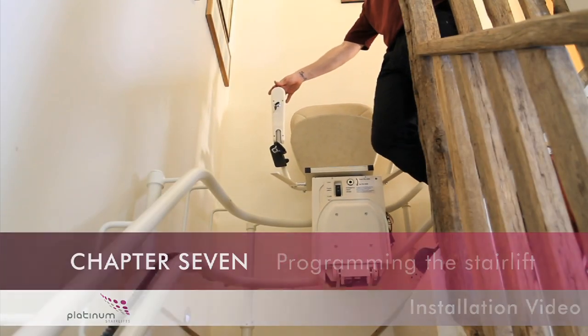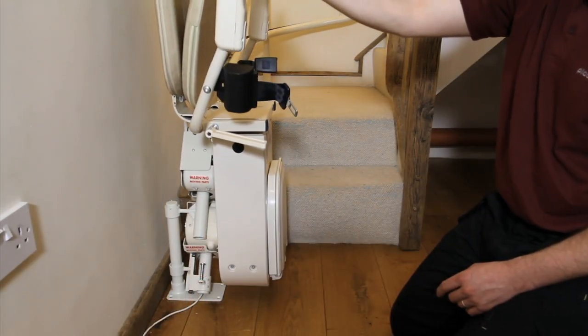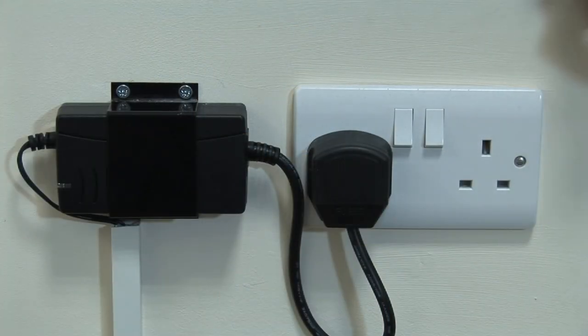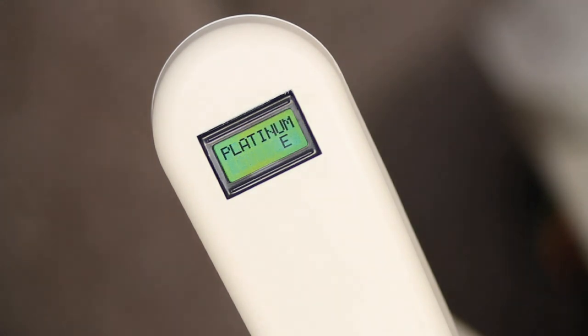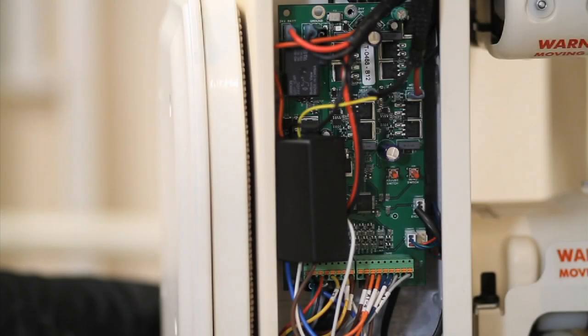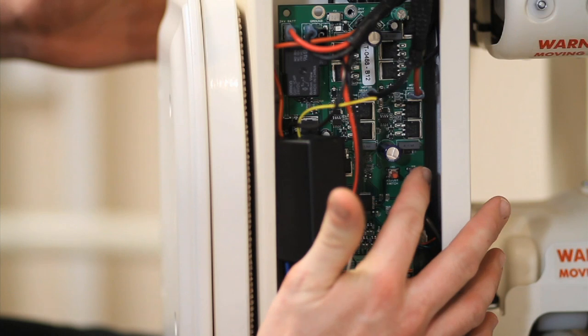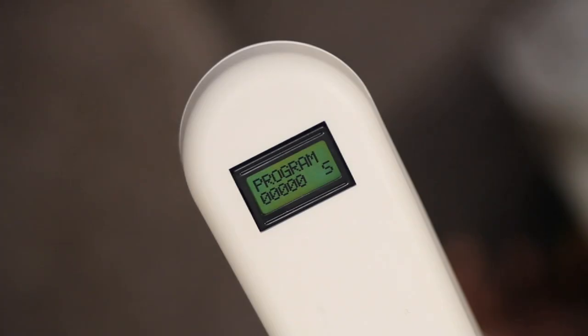Chapter 7: Programming the stairlift. In order to begin programming the stairlift, run the carriage all the way to the bottom end stop and onto its charging point. Switch the charger ON and, as mentioned previously, check the display reads PLATINUM and indicates that the stairlift is charging. Remove the right side cover of the carriage to access the PCB. Press the red menu button on the right hand side of the circuit board for approximately 8 seconds. The word PROGRAM will appear on the display along with an S in the bottom right hand corner. This S stands for slow speed.